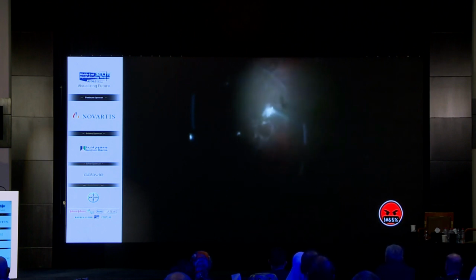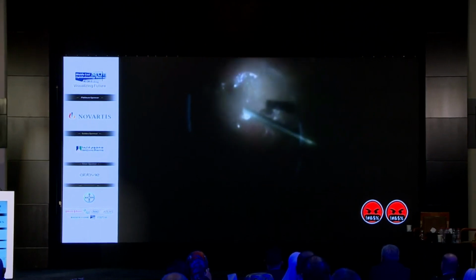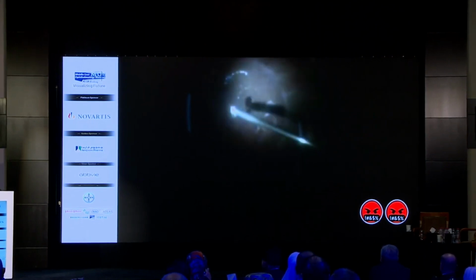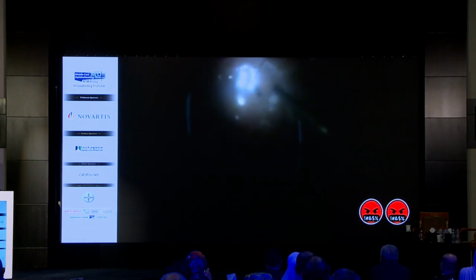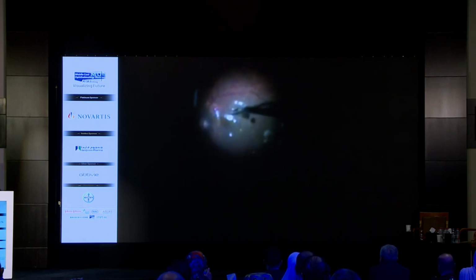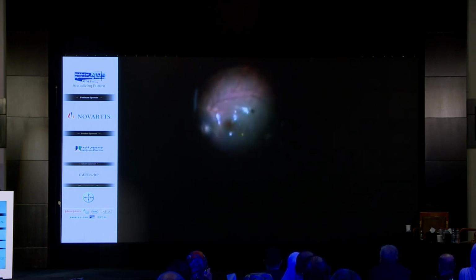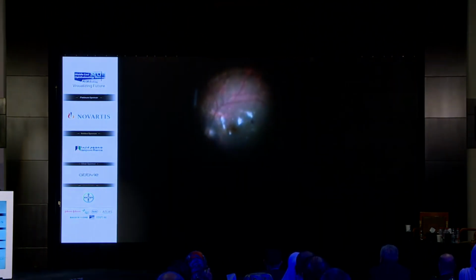I catch it, now it falls again. I'm starting to get pissed off. Maybe I use another method, getting it with the forceps. We'll get it now, trying to get it out with this.